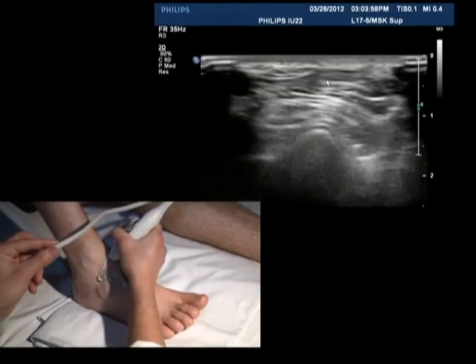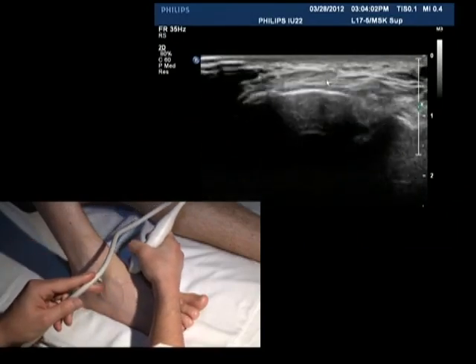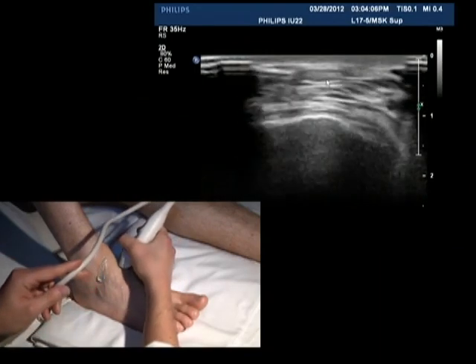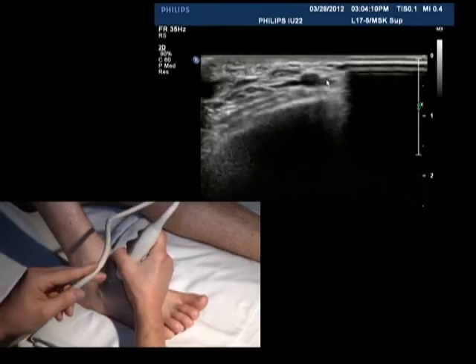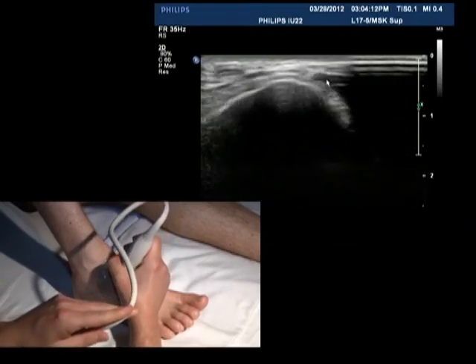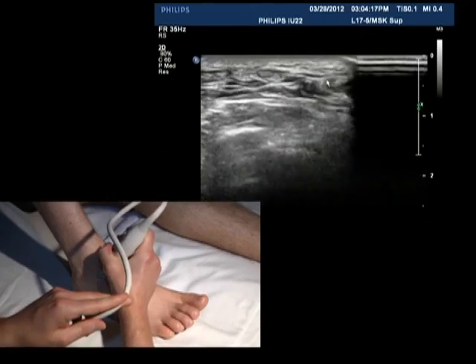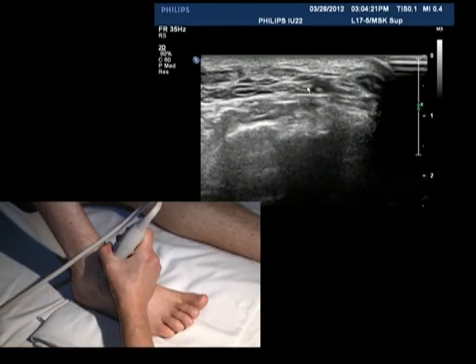And you can see the tibialis anterior right there where the arrow is going to go down to the medial cuneiform right there. And you can see this one is the largest of the 3 if you get lost. Here's the vasculature right here. And then if you move up and down, you can see a small nerve right here.